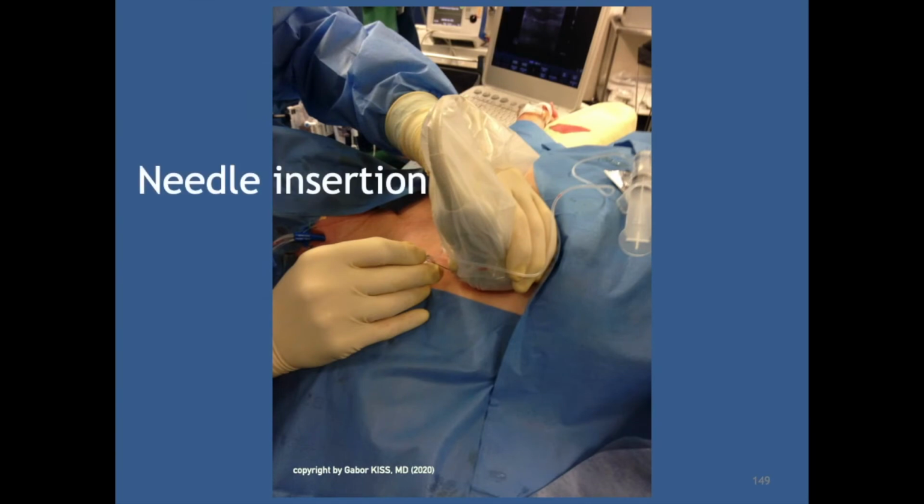After identification of the pleura, a blunt tip echogenic needle is inserted in plane to the transducer with bevel up. To ensure a constant visualization of the needle and to prevent pericardial puncture, the needle is advanced in an in-plane approach from caudal to cranial direction.